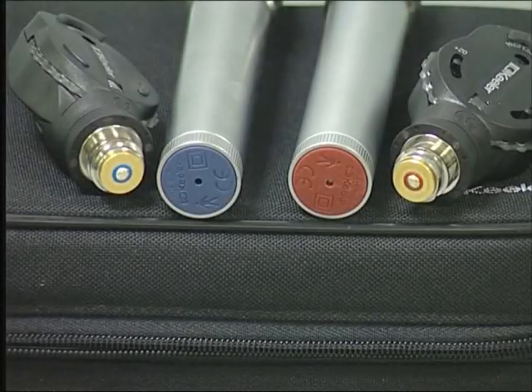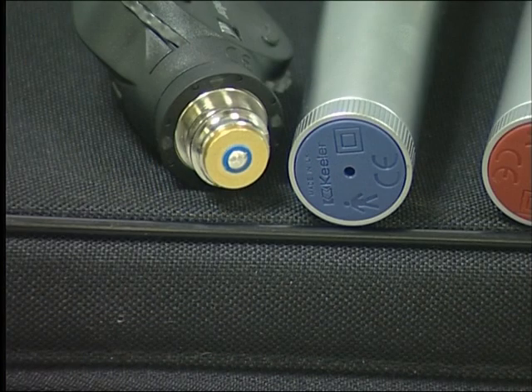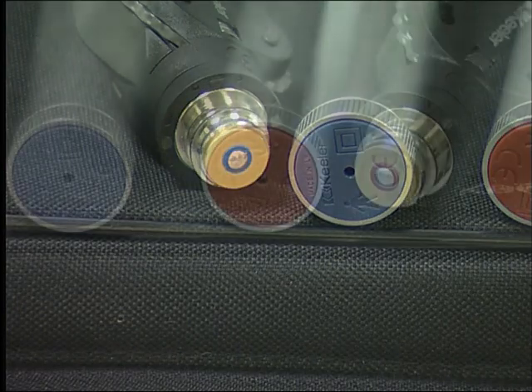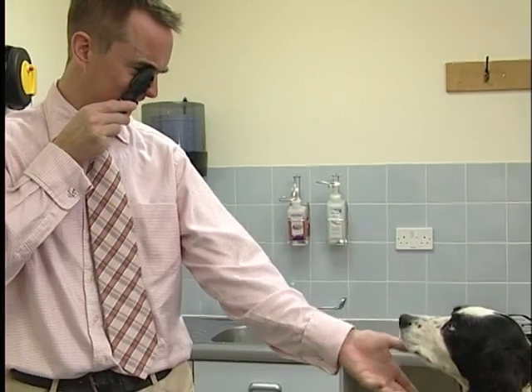It's important to check the voltage of the handle and ophthalmoscope head, as they come with two different voltages, a 2.8 volt, which is blue, and a 3.5 volt, which is red. These voltages are not mutually compatible.